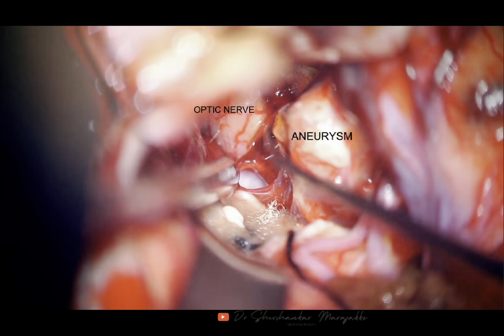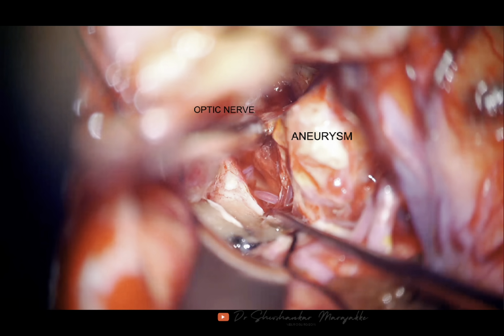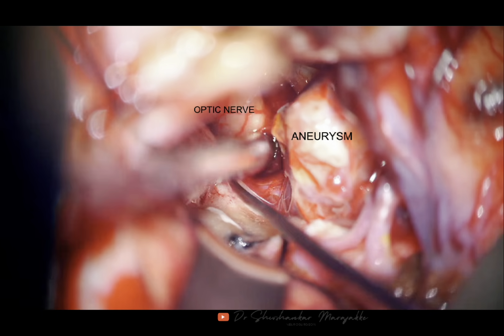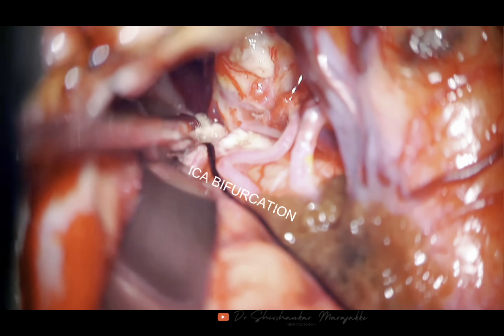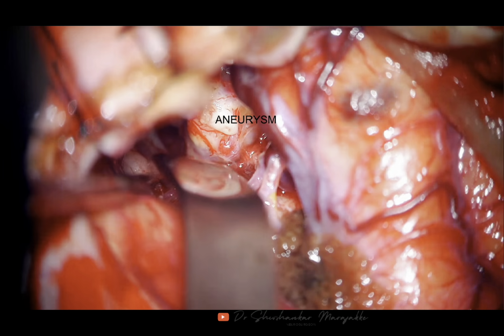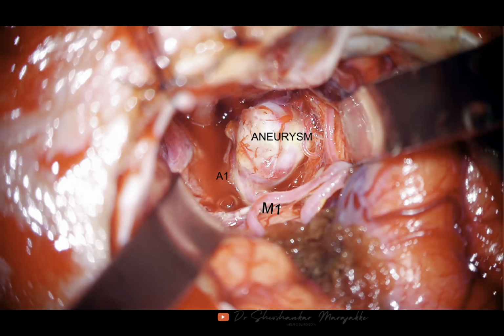So I have applied this retractor for some time, and you can see there are teeth there under my dissector. That is a clot I'm taking out, and the ICA bifurcation is coming into view. So we are literally excavating the aneurysm from the frontal lobe and the blood clots around it.